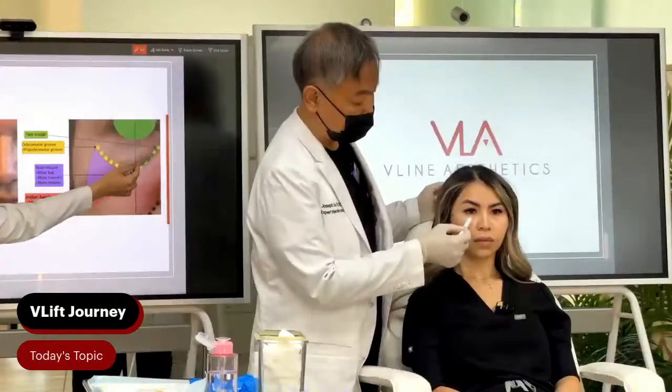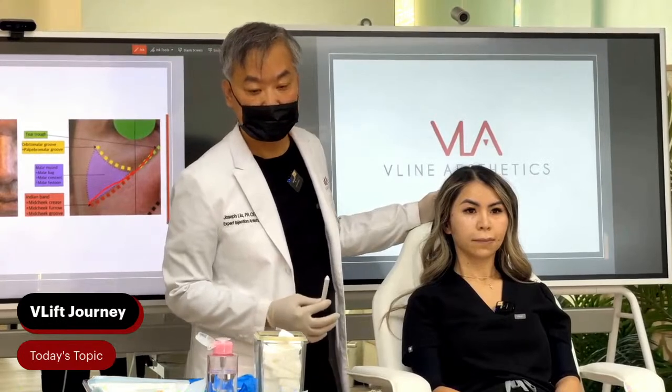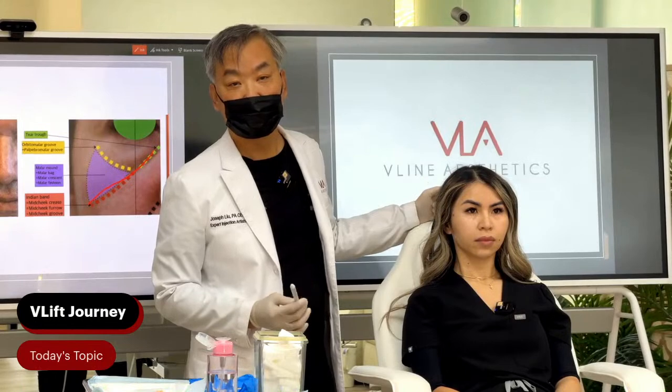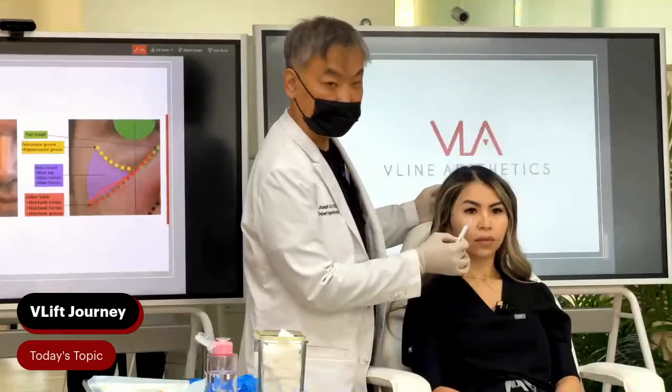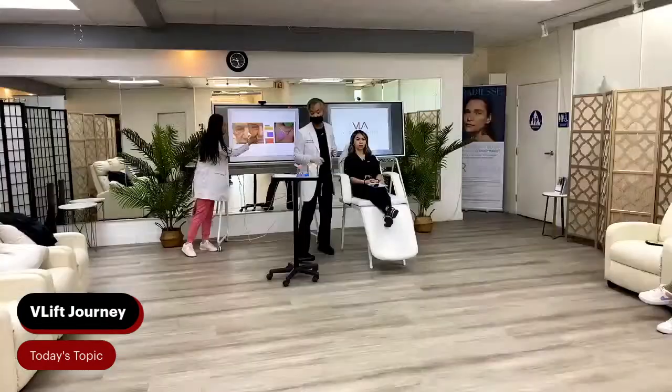So we had a client who was concerned about this line right here, which is actually called the nasojugal groove. There are certain other words like the crease, the furrow, the groove. And as you can see right here, there's a little bit of edema, the malar edema, the malar mound, malar bag. And so we used Radiesse to help lift, and as you can see, it's much more blended in this region.